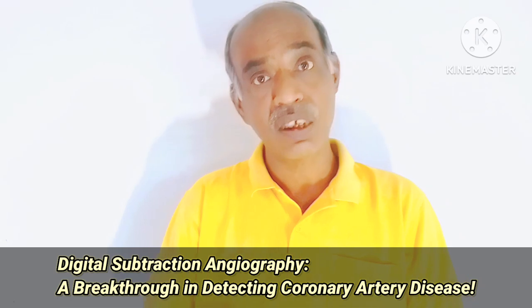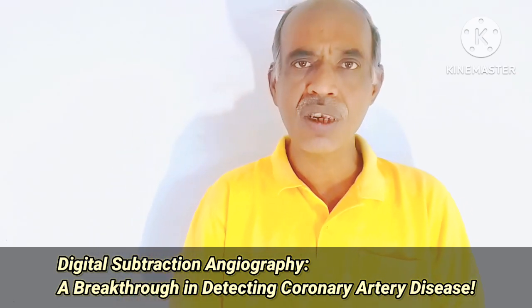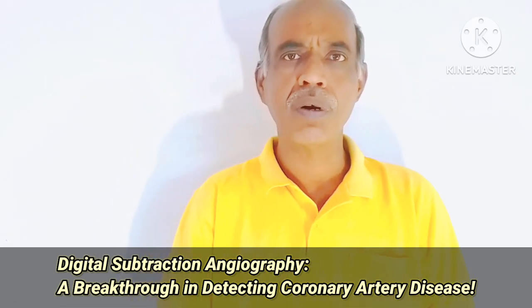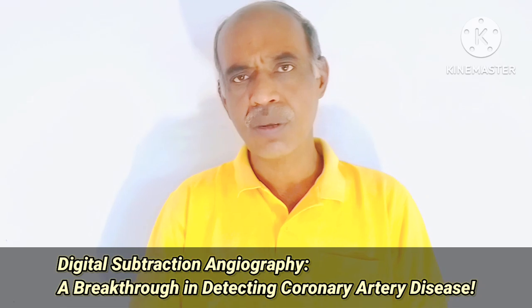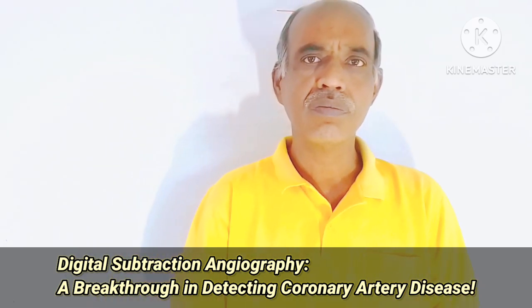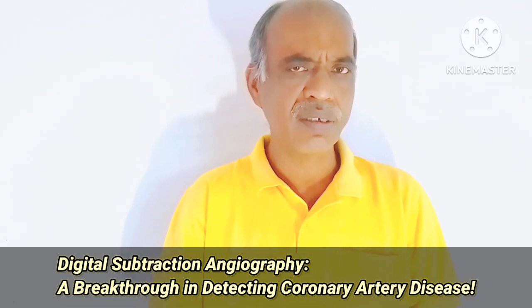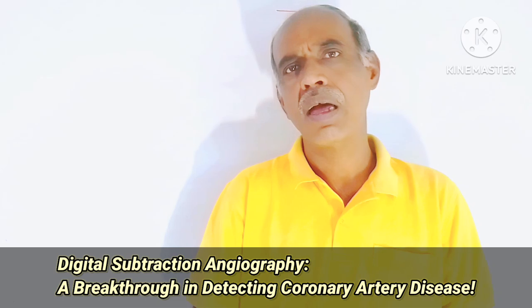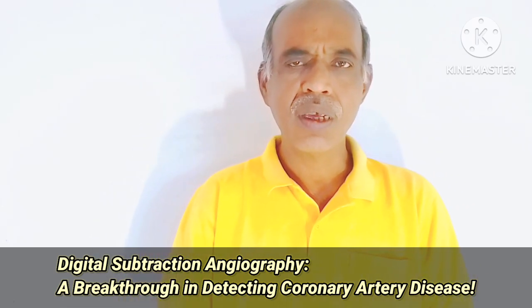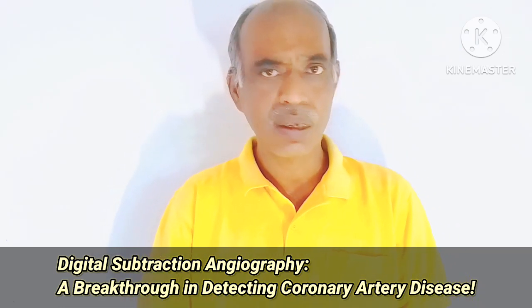Unnecessary things are removed this way by subtracting the initial image from the final one. And this is the advantage of DSA, digital subtraction angiography, over conventional angiography. This is the main benefit. This technique actually helps in angioplasty and placement of stents.